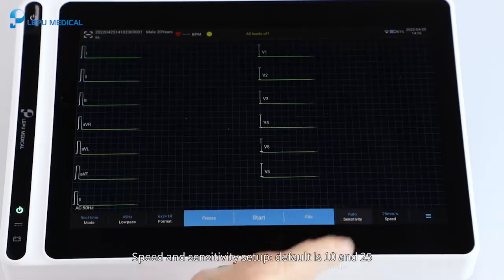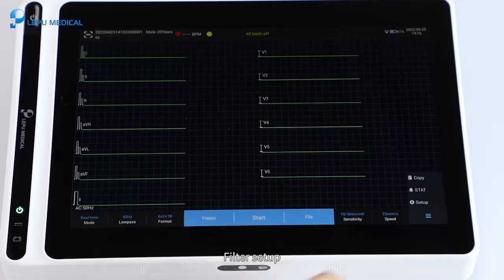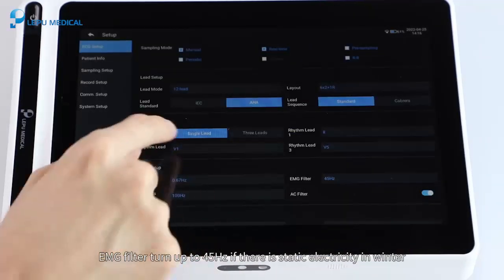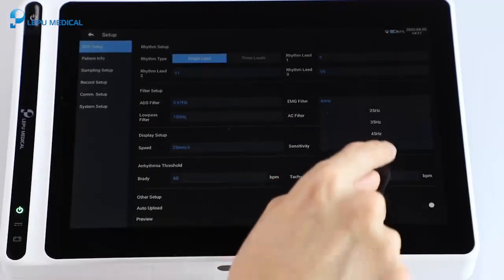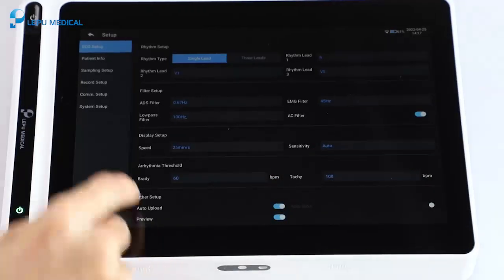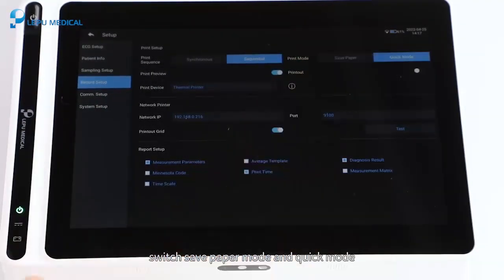For speed and sensitivity setup, the default is 10 and 25. For filter setup, turn the EMG filter up to 45 Hz if there is static electricity in winter. For print setup, switch to save paper mode and quick mode.